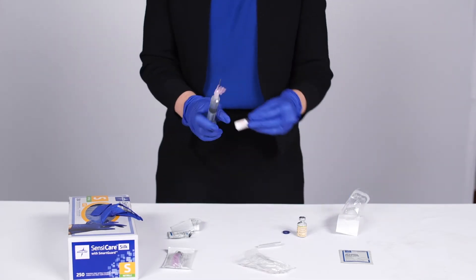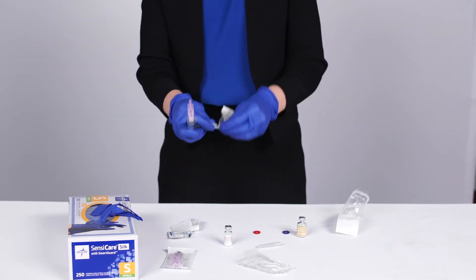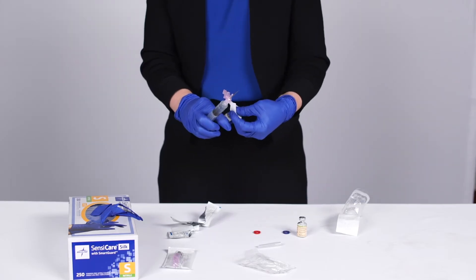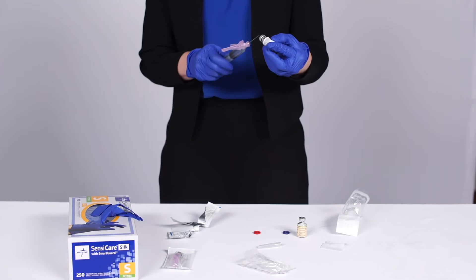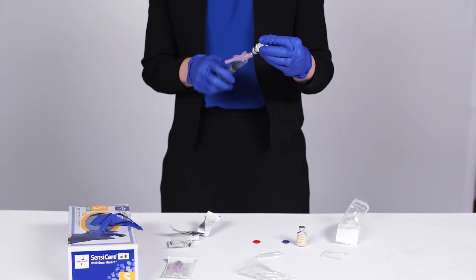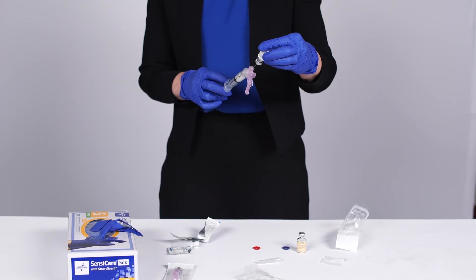Next you'll draw up the steroid. Again clean the top with alcohol. Put a little air into the vial to make it easy to draw up, and you'll draw it right up into the same syringe.